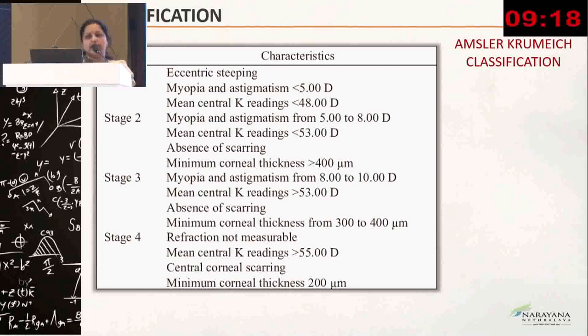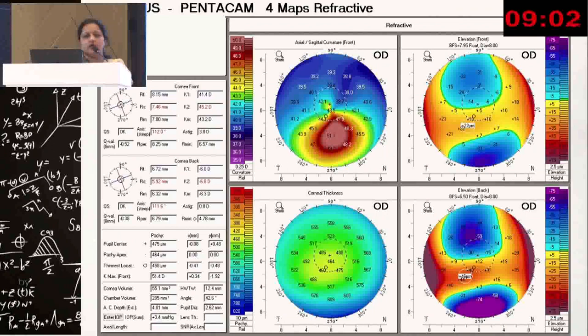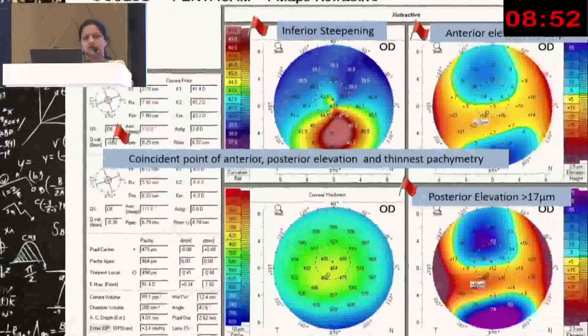There are a lot of other classifications, but it is out of scope for this discussion. What should we look for? Initially, I shall tell a few points about the Pentacam, only basic points. That is the inferior steepening, posterior elevation of more than 17 microns, anterior elevation of more than 12 microns.